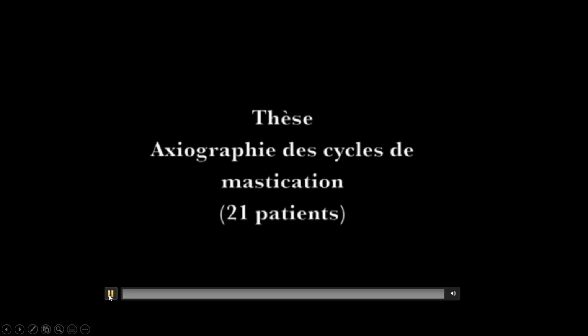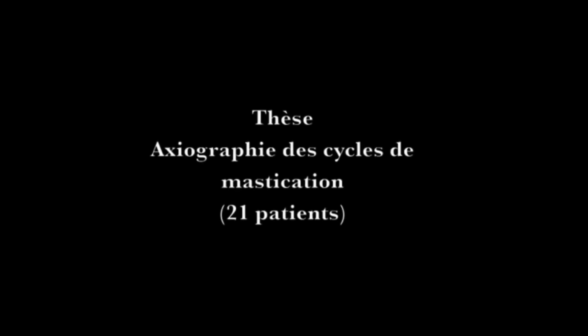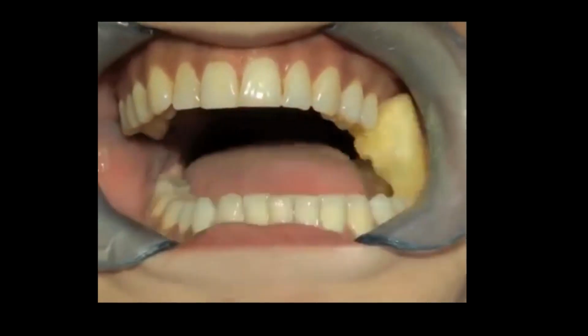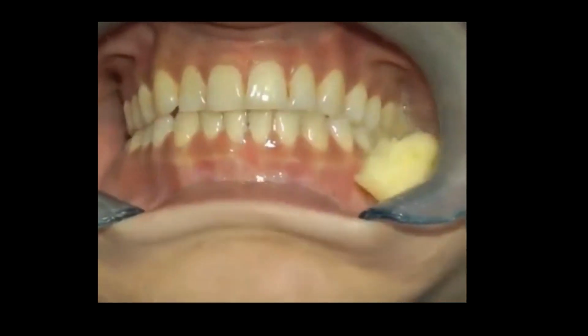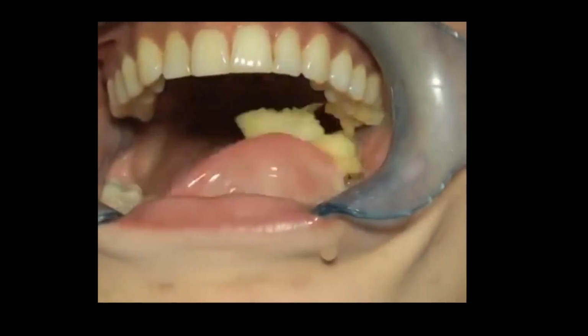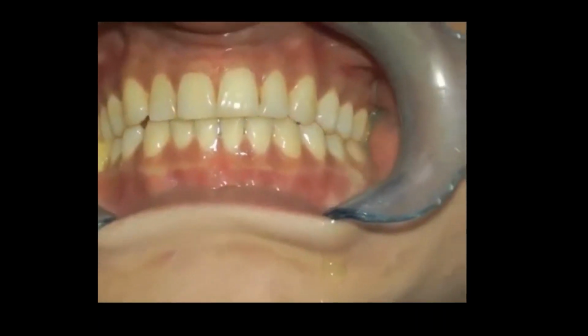This is a video of people chewing. So they have real teeth, but this is the point of what I want to show you now, they're going to chew a little bit. So watch them chew the apple, but I want you to look at their jaw and watch the angle of their jaw. Your chewing is in a teardrop, but the teardrop varies from patient to patient.